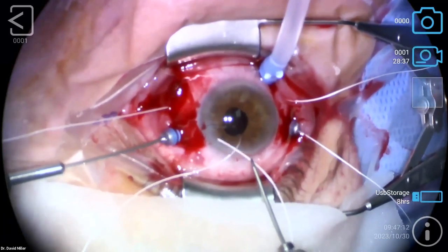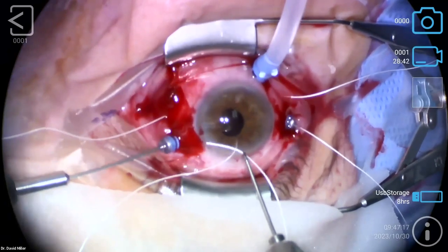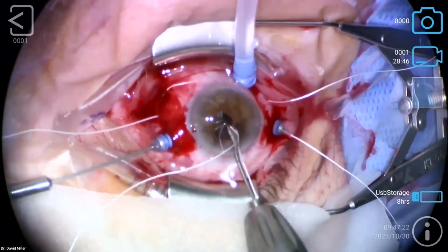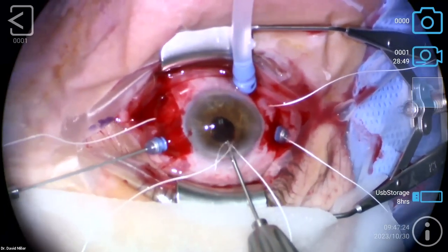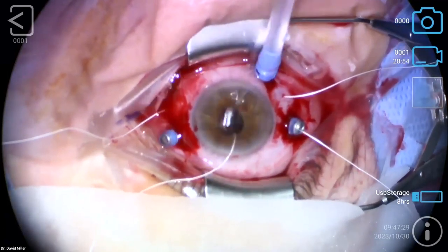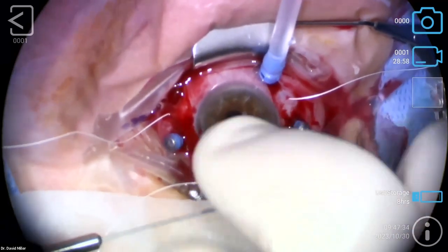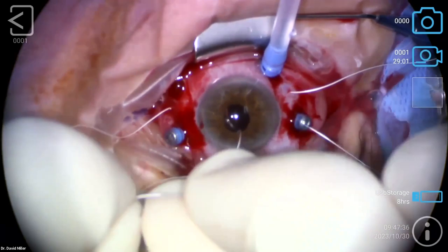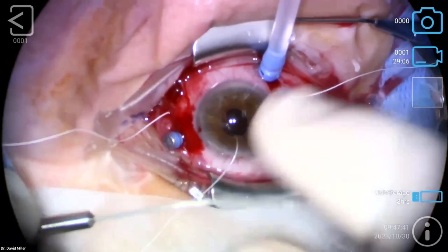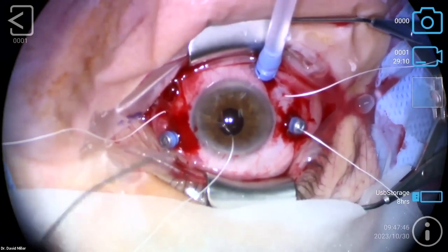And take your head over a little bit. Now you can see my forceps are above the lens implant. Oh no, they're not, they're behind. That's no good. I'm going to bend that forcep right now, which I was showing you guys or talking about earlier. So I'm just going to take this forcep, get a little bend here on the shaft. If it's some risk, you could break it, of course. But for the most part, very well tolerated. That makes a huge help working on the nasal side.